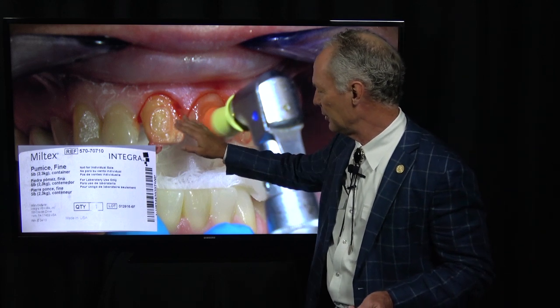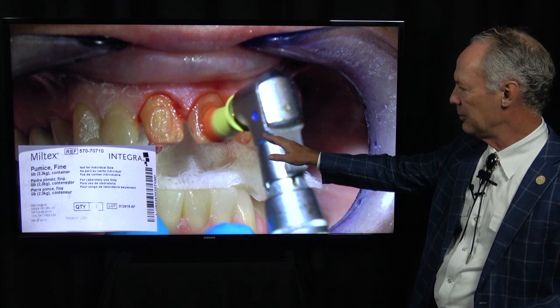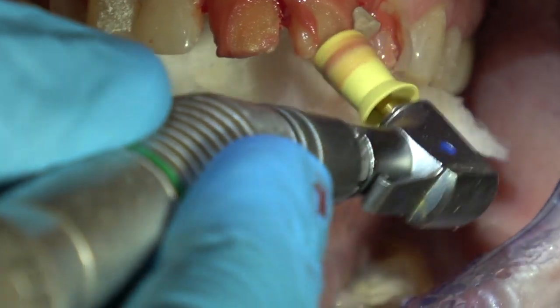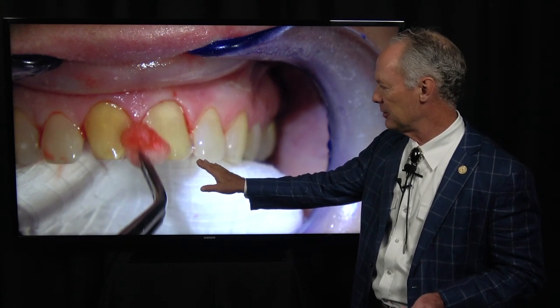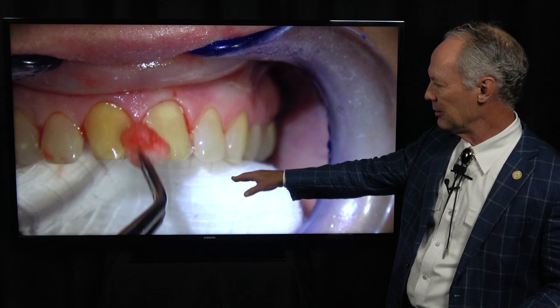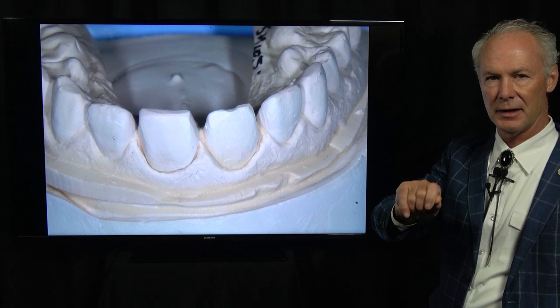Once I've removed the provisional as well as I can, I'm going to take a coarse football diamond and reprep this area ever so lightly, to be sure all the filled resin and provisional bisacrylate is off the tooth. Then I'm going to pumice with a prophy cup and pumice mixed with water to get any little remnants of adhesive off. Then I'm going to wipe the teeth with isopropyl alcohol on a cotton ball. Be sure to put a 2x2 in the mouth — it tastes awful.